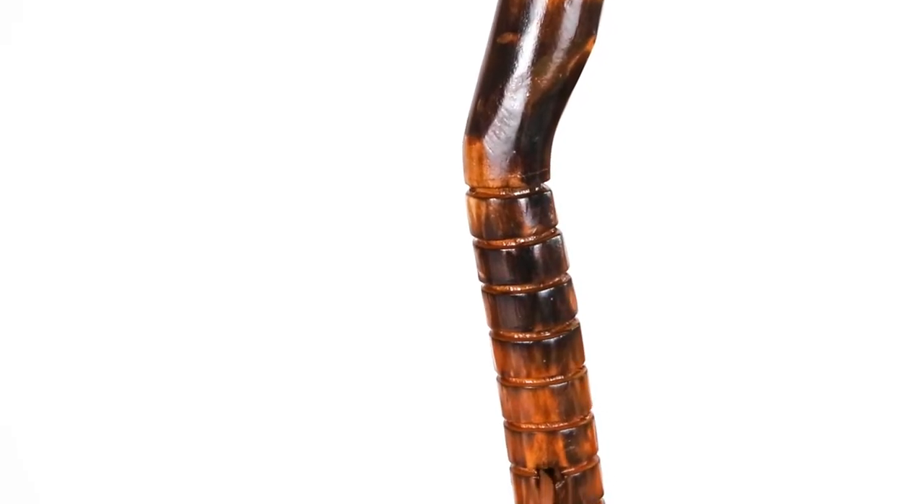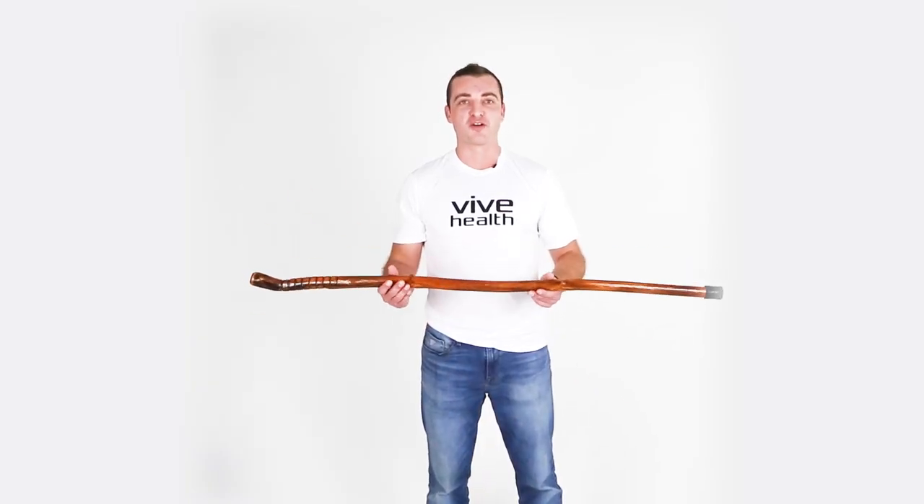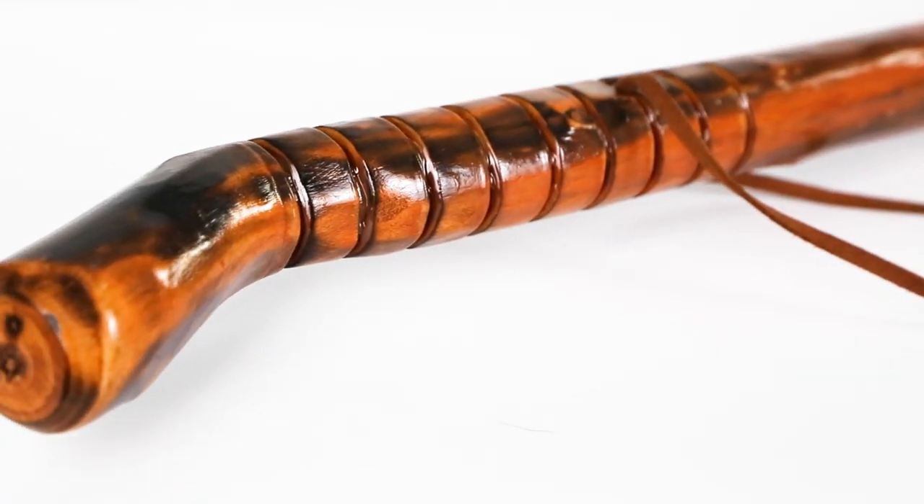Smooth grooves along the upper portion of the hiking stick create a comfortable non-slip grip, and each wood cane is finished with a clear waterproof protective coating for durability.